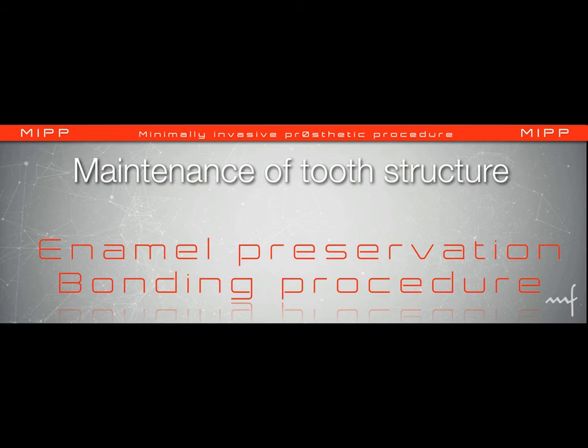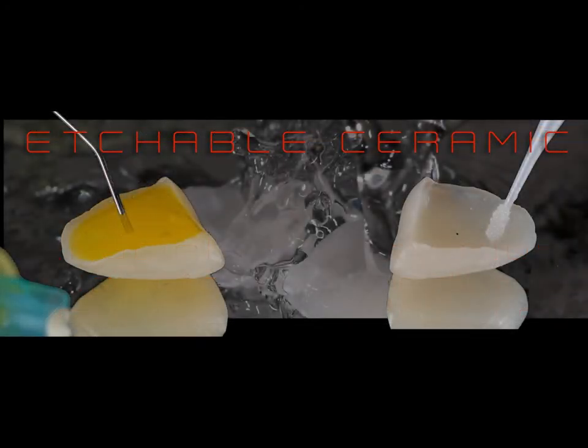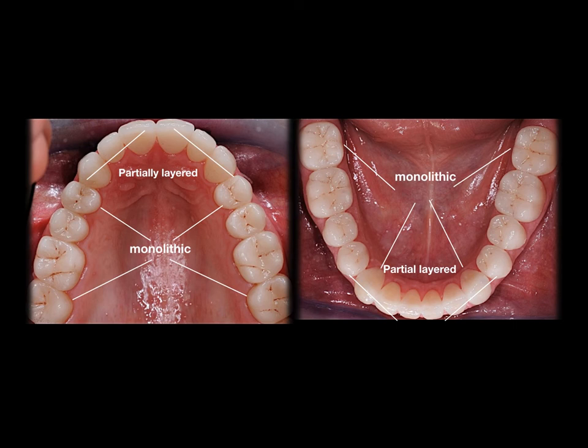So, again, the second step and now the first step. In order to maintain tooth structure, that is still our goal, we have to preserve enamel. Because if you preserve enamel, you really can say you have created a very safe and predictable bonding procedure. Of course, at this point, having enamel underneath, we need to use an etchable ceramic that has to be etched with hydrofluoric acid and then to put silane and then to follow all the bonding procedure. So at the end, we have achieved this kind of result. Nice result in terms of aesthetics, but what we really need to know is that we have monolithic material on posterior and a layered porcelain on the vestibular area of the anterior in order to optimize the aesthetic result on the upper jaw and in the lower jaw.